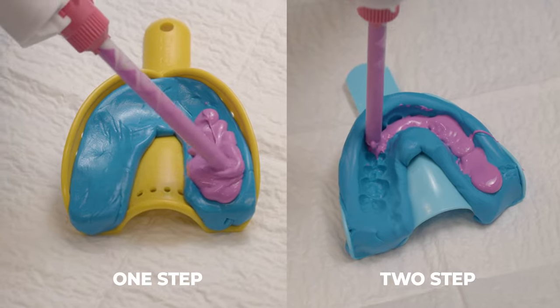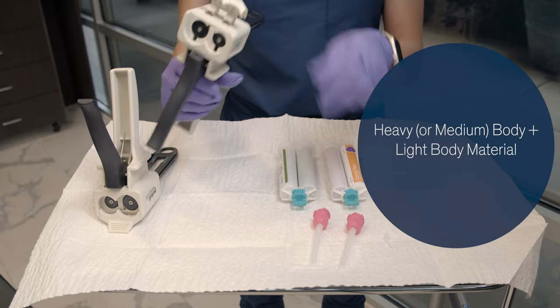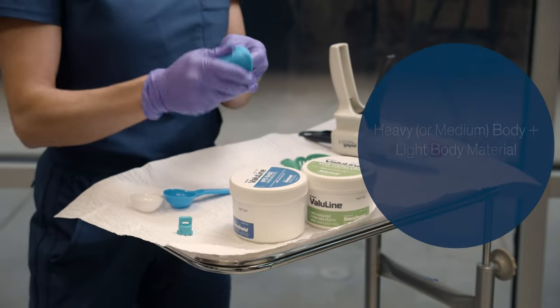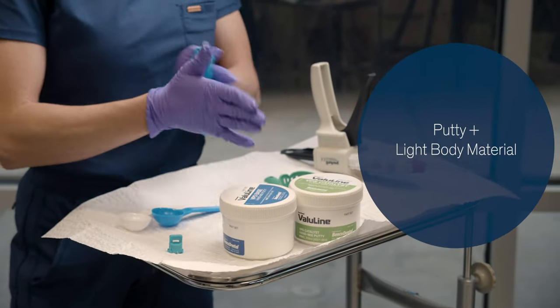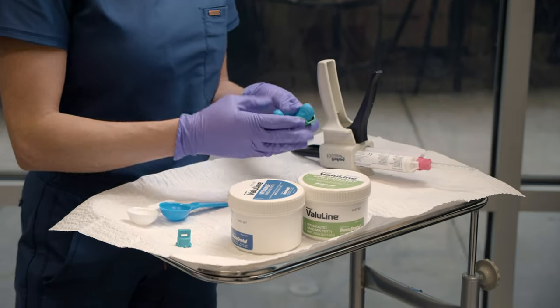The approved materials are either a heavy body and light body PVS material, or a putty and light body material when taking the PVS impressions. In order to take a traditional PVS impression using heavy body and light body, these are the materials that you'll need.